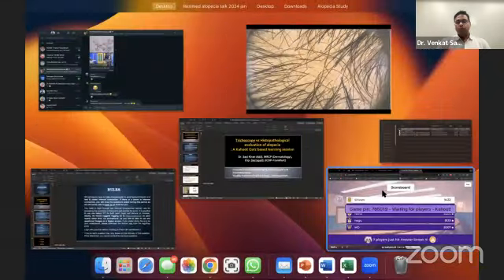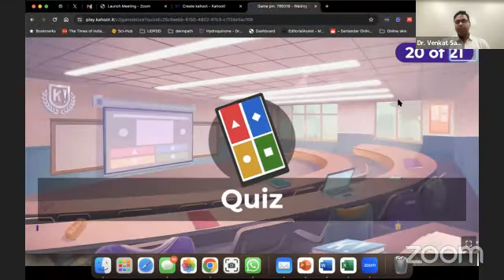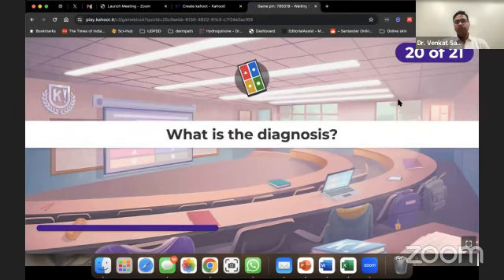I'm seeing white dots, yellow dots, black dots, miniaturization, catagen telogen shift. Are you able to see that? Or are you not able to see it? Are you able to see a pigment network? Is it normal? Is it broken? Okay, I think you've had enough time. So this is actually an easy case. So last question, an easy question. Let's see what the leaderboard is like after this.